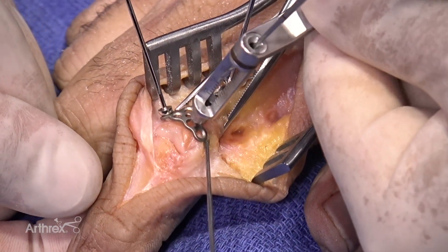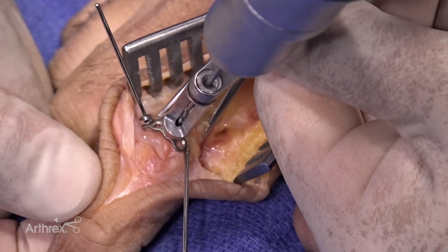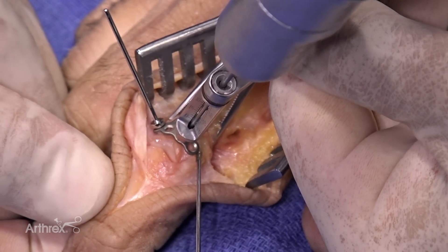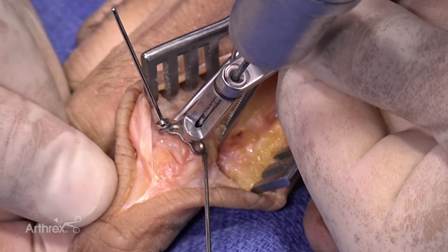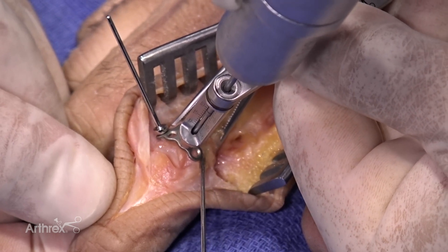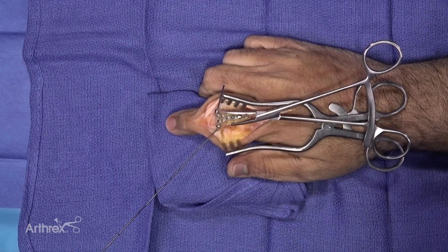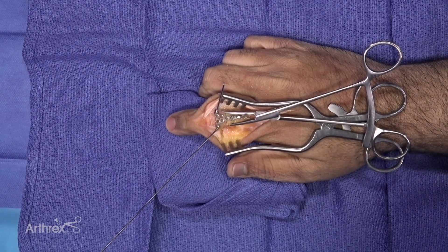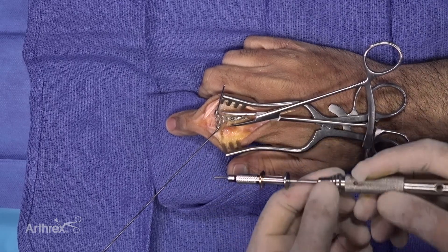I'm going to put one screw in distally and show the variable angle feature. I'll aim a little more proximally to make sure I'm away from the joint. I can feel the other cortex and I'm at about a 10, so I'll probably be okay with an 11 or 12 millimeter screw. This will be a locking screw, so I don't need to go much past the cortex.